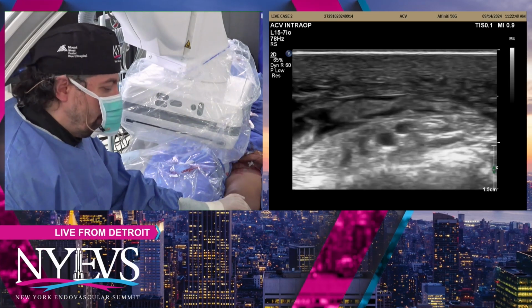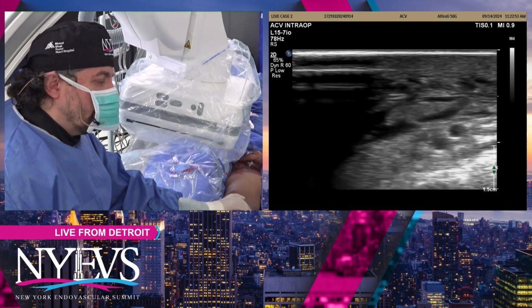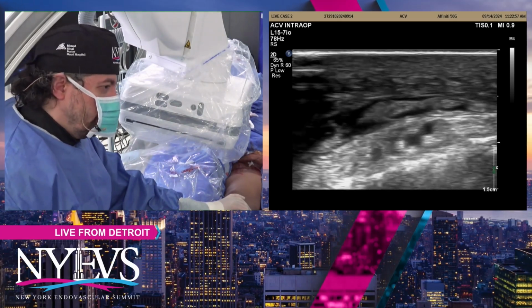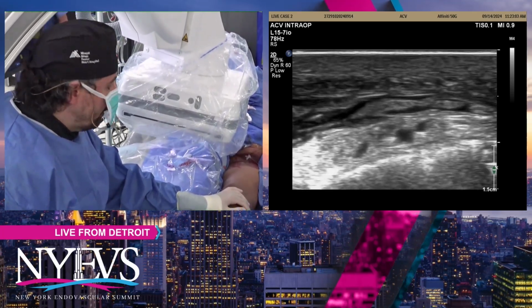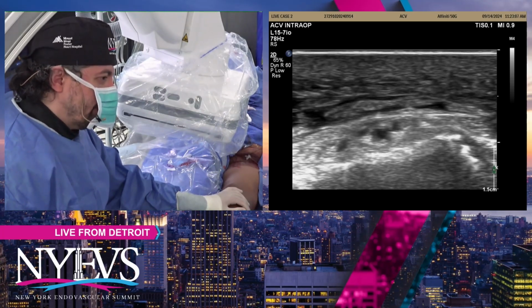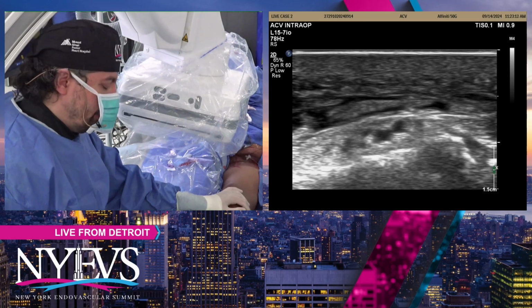I've told some people also, if they work in a hospital environment, right now we're working in our ambulatory surgical center, but if you work in a hospital environment, you can work with your imaging department to develop a protocol where ultrasonographers can come assist you in obtaining pedal access, for example, and leave the case. And we successfully managed to do that in our hospital environment.